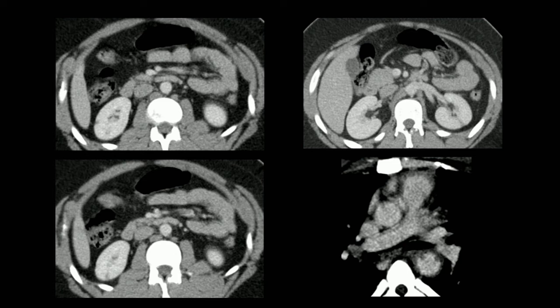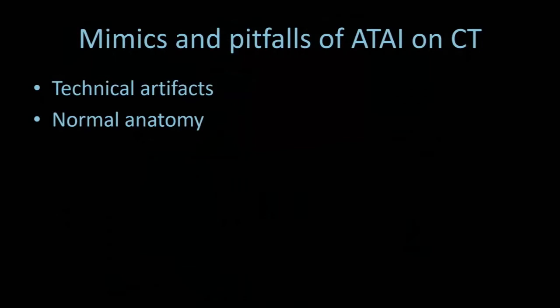Patients with acute traumatic aortic injury who have thrombi often have sequelae. They can embolize distally. If you're dealing with a patient who has trauma and has evidence of infarcts in solid organs or the bowel or you see an embolism, make sure you have imaging of the chest and go upstream to look for a subtle aortic injury. This patient was in a motor vehicle collision with back pain. They had multiple infarcts in their kidneys. When you went to their chest, we found two small thrombi at the site of aortic injury.